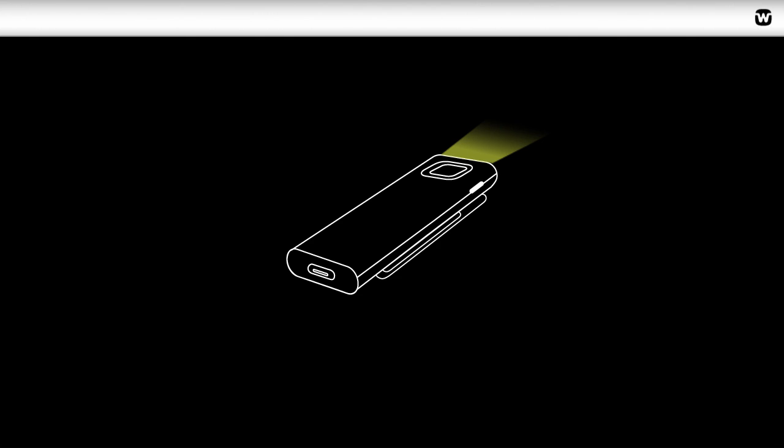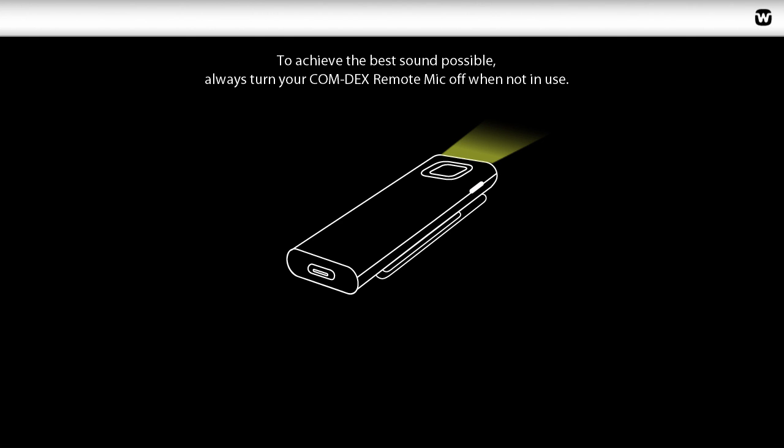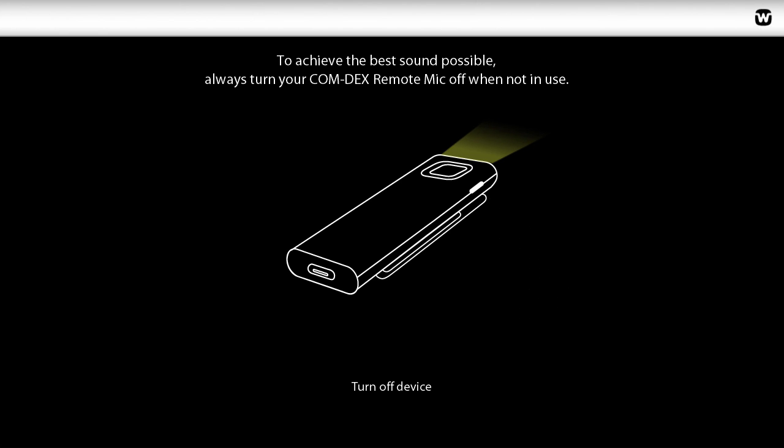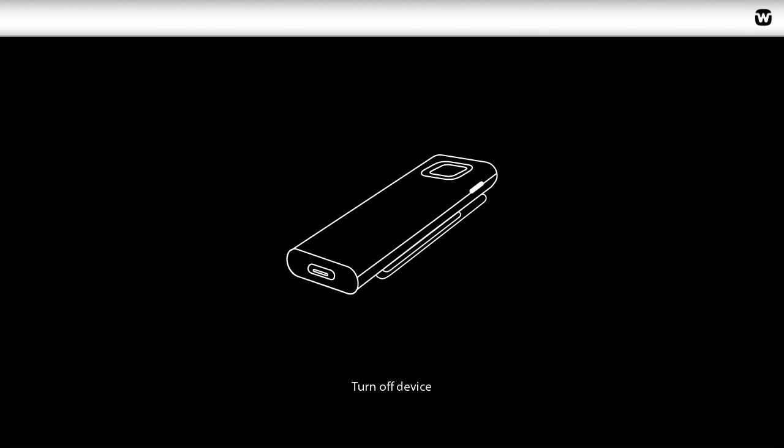To turn off the Remote Mic, press the Power Button for three seconds. The Remote Mic will turn off automatically if it hasn't been streaming sound to the Comdex for more than 30 minutes.